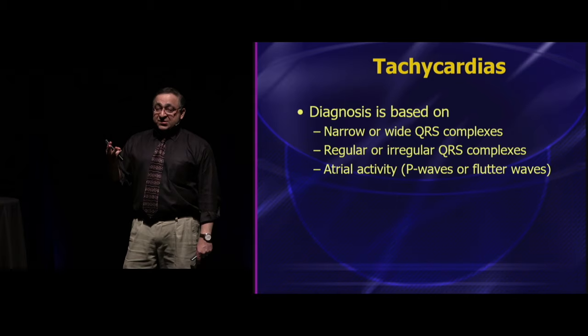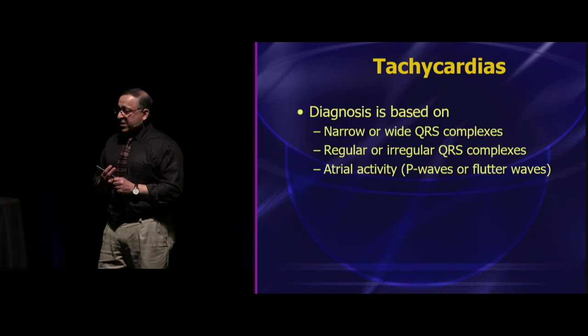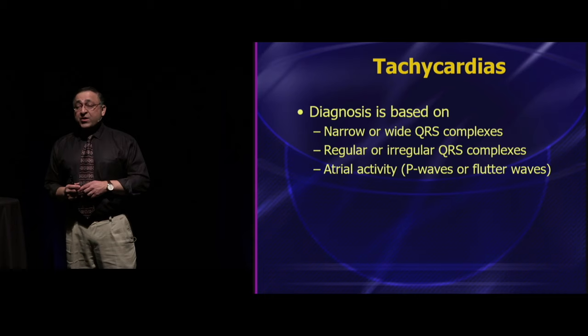Is it wide or narrow? Is it regular or irregular? And then, what's the atrium doing? If you ask these three questions every time you look at a tachycardia, again, you're going to nail your diagnosis. So we're going to do some differentials as we go through this.